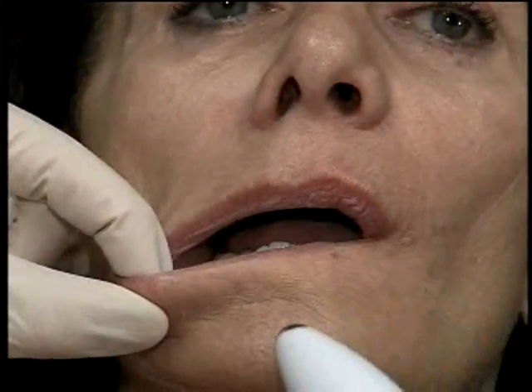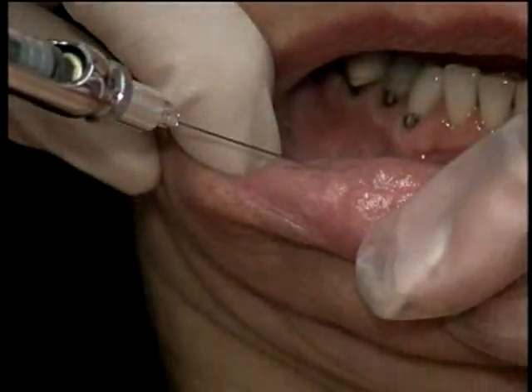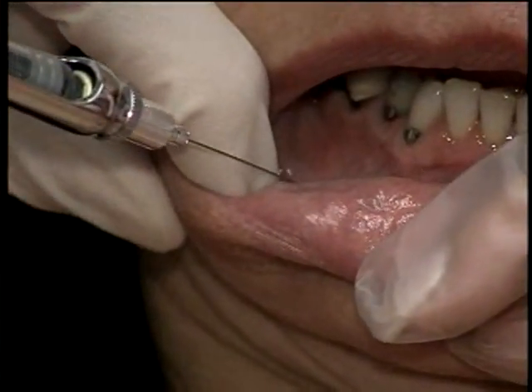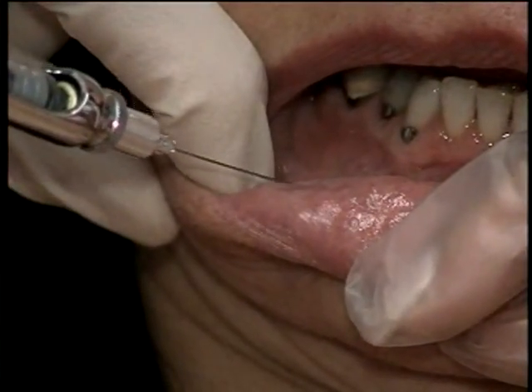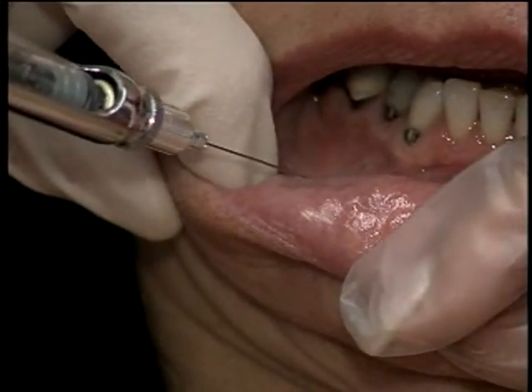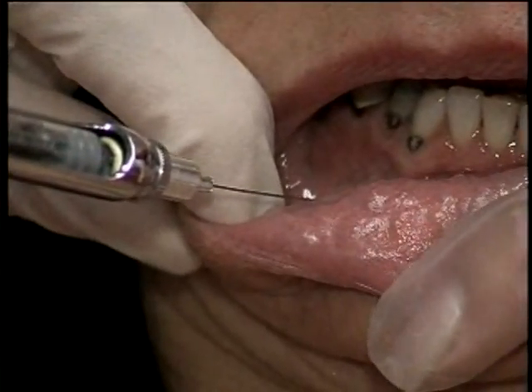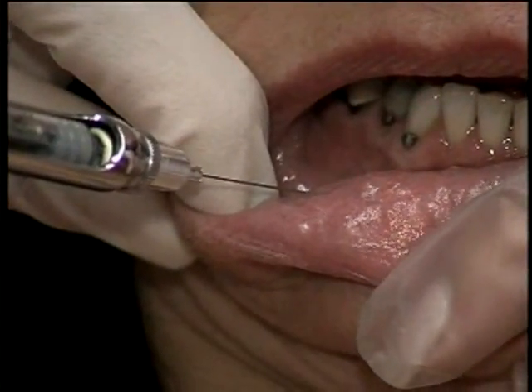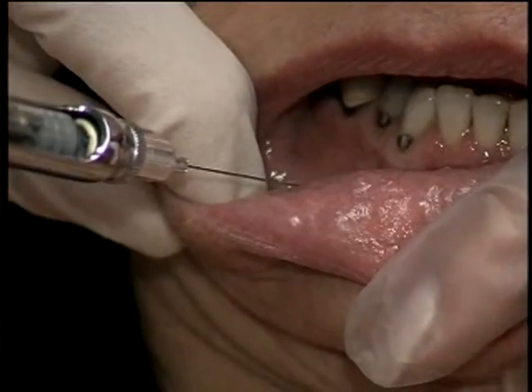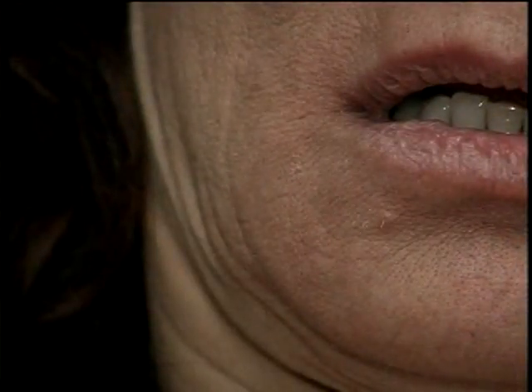Now we'll do the lower lip. So I retract the lower lip. I follow the second premolar down to the foramen. I don't want to inject the foramen. Now I'm next to the foramen, injecting right next to it. I can actually see the foramen, so I'm depositing just a little bit of product right there. 0.25 cc's. Okay, now let's do the opposite side.